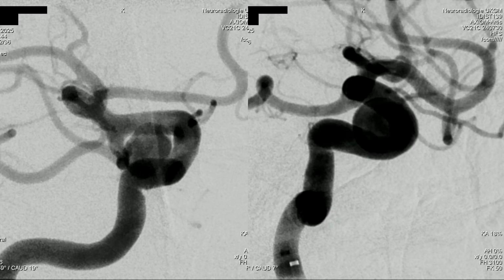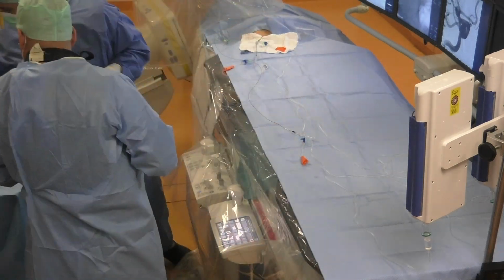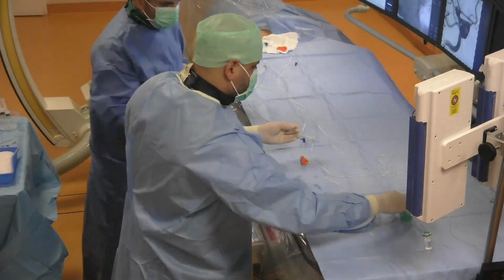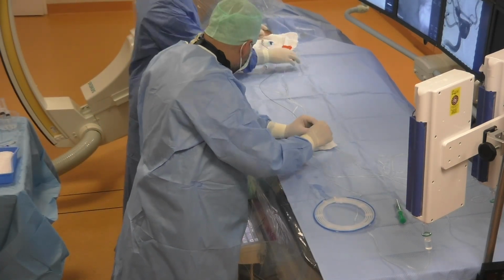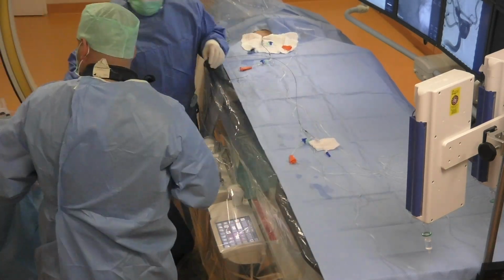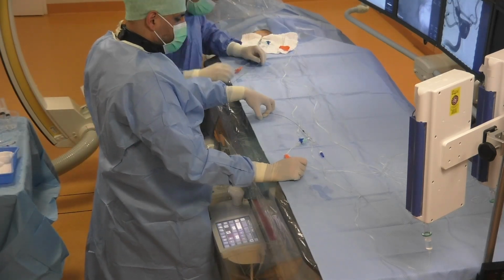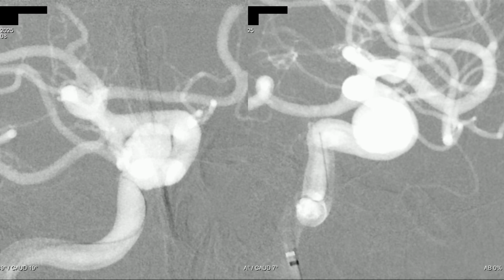Now we take our microcatheter for the coiling. It's a PX Slim, a 25 microcatheter with a length of 150 centimeters. We push the microwire inside the microcatheter, shape the tip of the microwire, and push both in the intermediate catheter Sophia 5F. And now we can start the navigation.